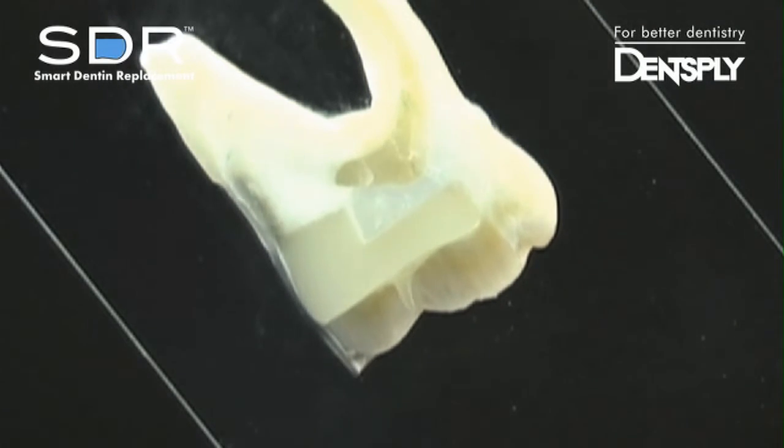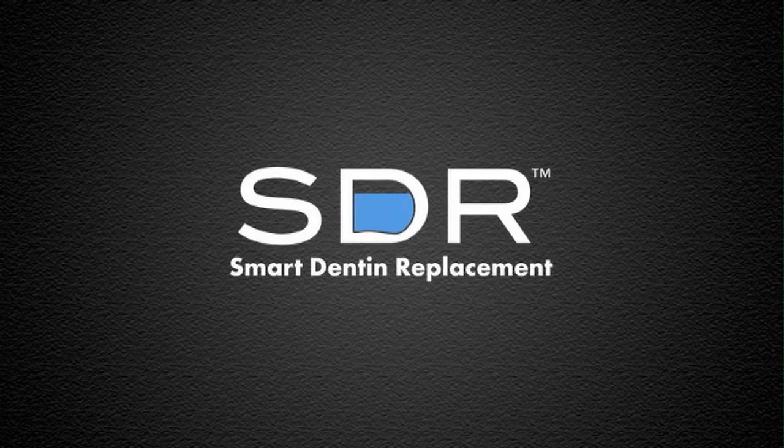Self-leveling and bulk fill — a revolutionary posterior flowable composite any way you look at it. SDR, Smart Dentin Replacement, the only bulk fill self-leveling posterior flowable base.